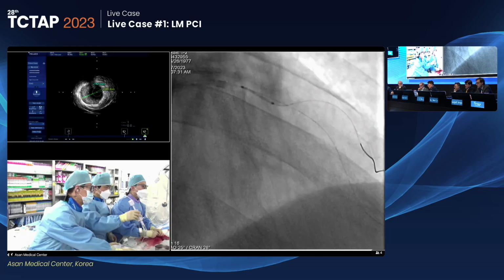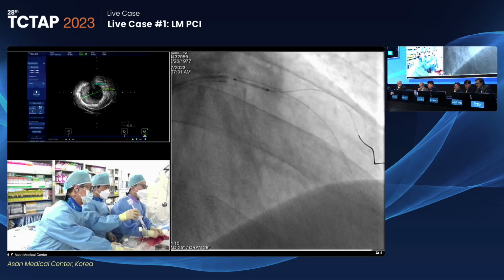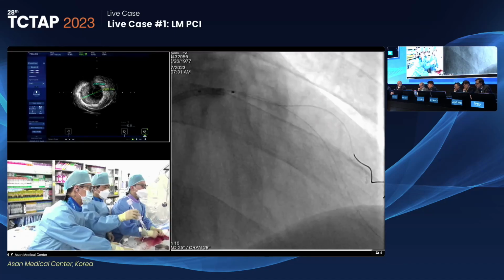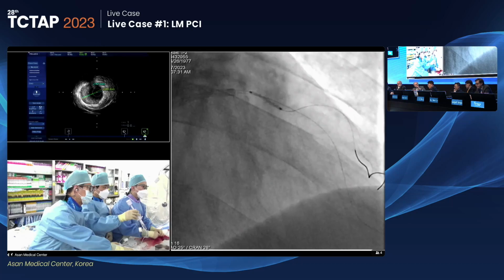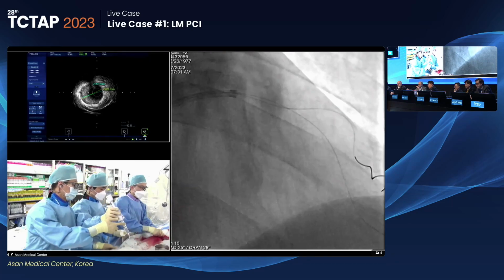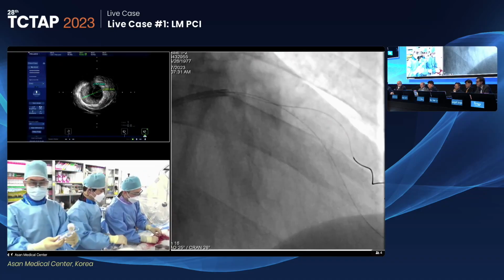All right, well, we have the options of one, shorter stent, two, guideliner, or three, no stent. I go for the third one. Why not a bigger cannula angiogram? We can see an angiogram and see how he looks at this diagonal. I agree. Shorter stent, please.